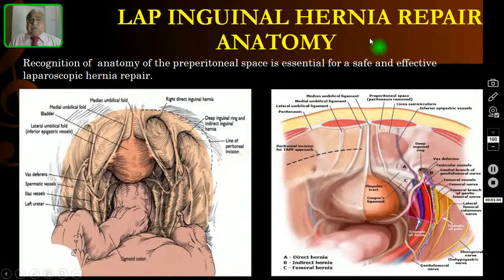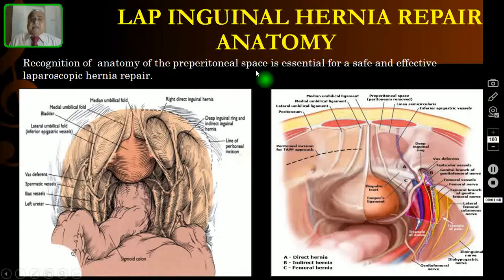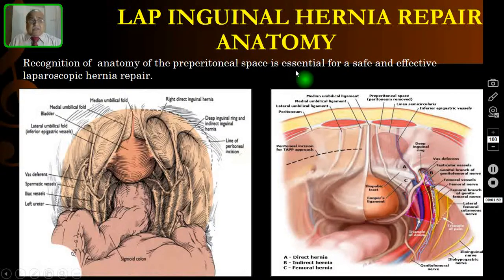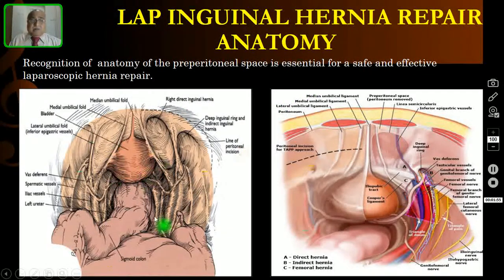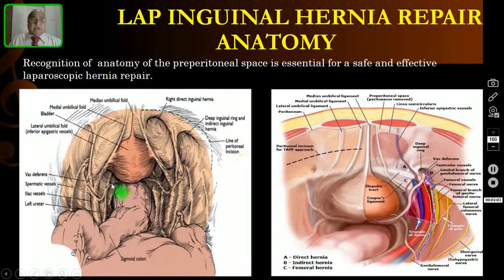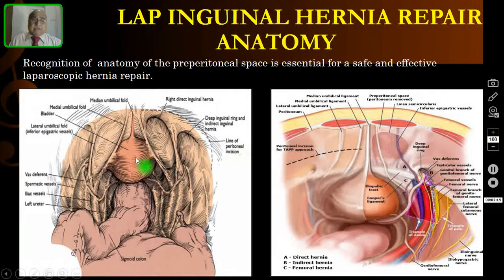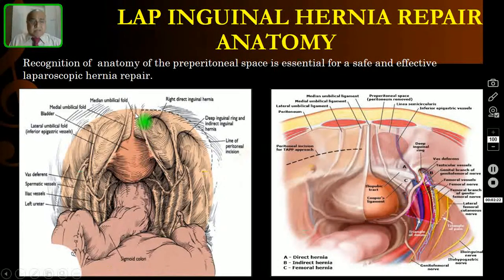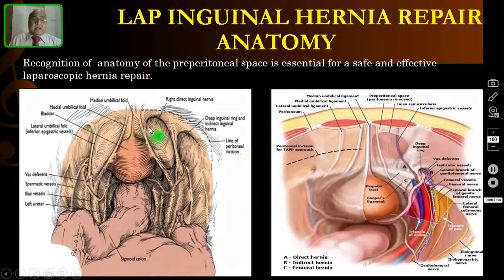In the laparoscopic inguinal hernia approach, recognition of the anatomy of the preperitoneal space is essential for a safe and effective repair. This is the anatomy after entering into the peritoneal cavity. Looking downwards towards the pelvis, centrally you are seeing the bladder. You should recognize some important anatomical landmarks: the median umbilical ligament, which is the remnant of the urachus, and laterally the medial umbilical ligament on both right and left sides.